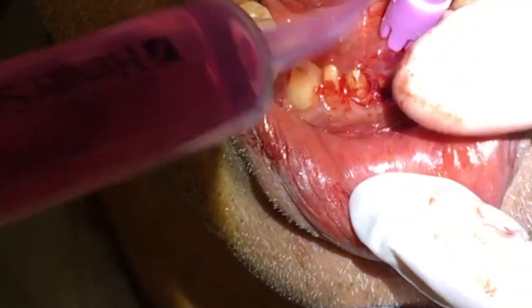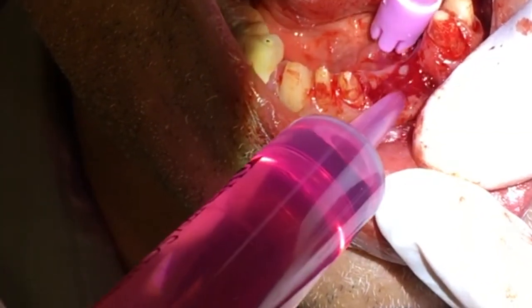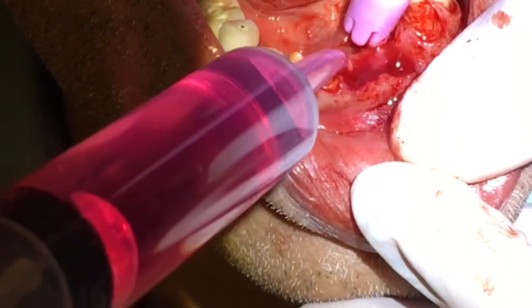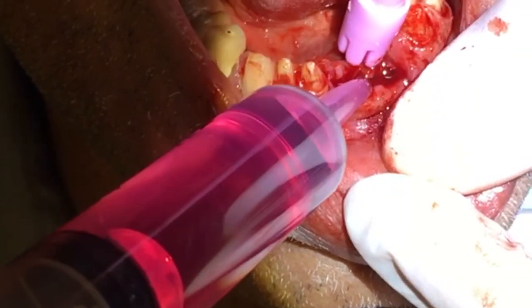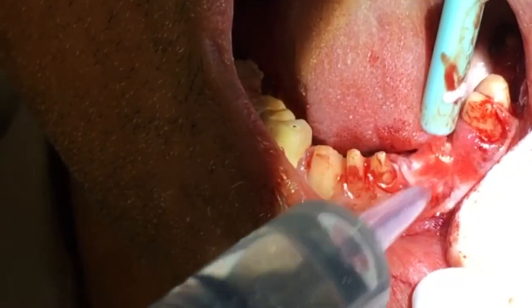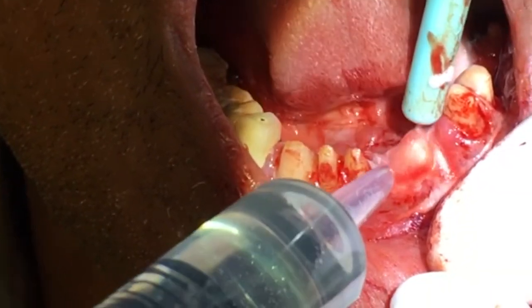Lastly, we're going to irrigate the socket. We go in with this pink solution, which is Paradex first, then we rinse with water, and then the blue solution that has that bubbling effect — that is the Peroxol — and we rinse that out with water.